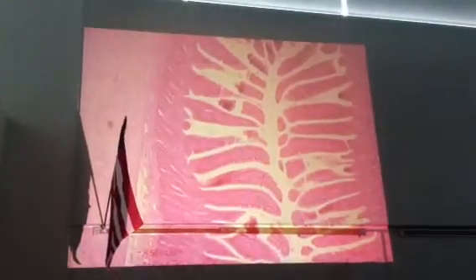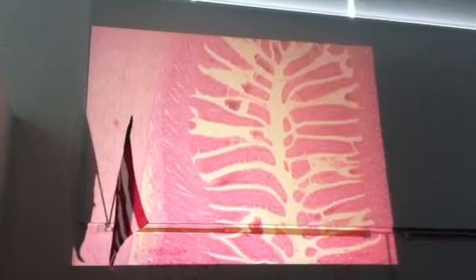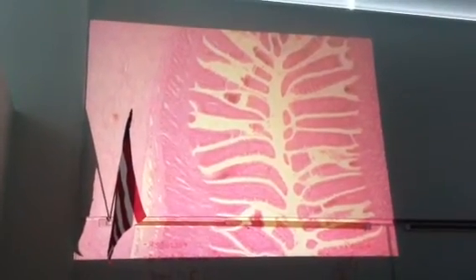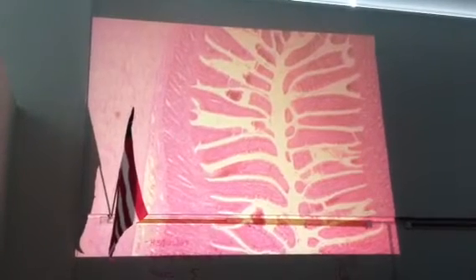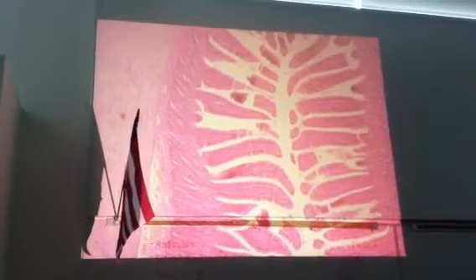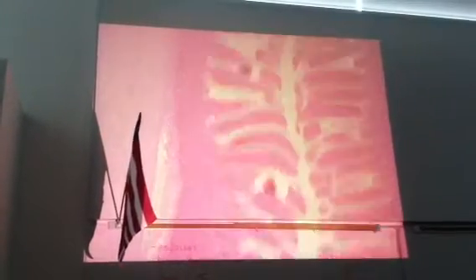Okay, so once you see villi, and I've got a handout for you today that I'll give you in class, you can kind of ask yourself, where am I in the digestive tract? When I see this, the first is that. And so if I see the first thing, then I ask myself a couple of other questions. So you kind of just go through that as you're trying to assess what happens to be here.